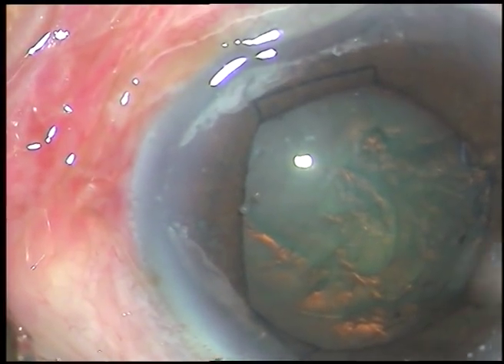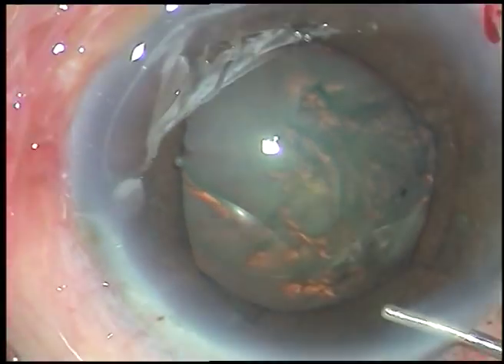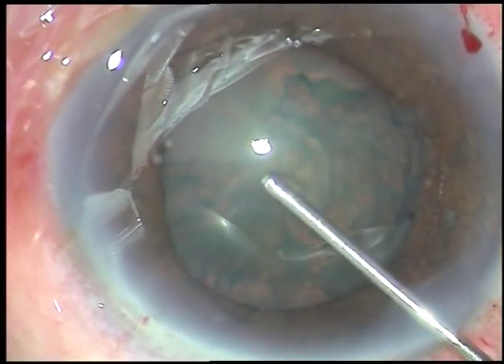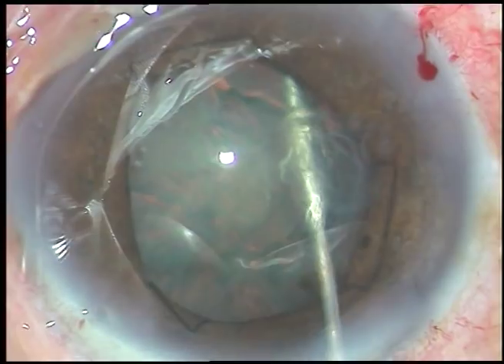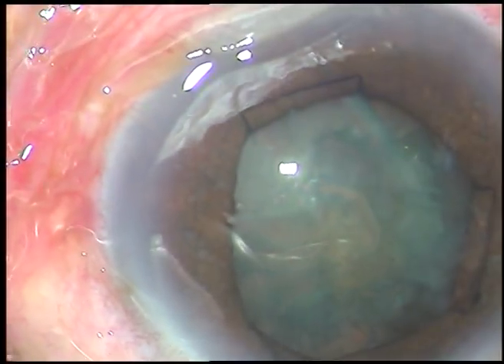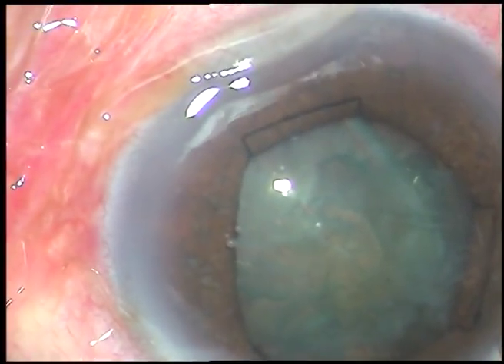Now hydrodissection. The cornea has become clear now — initially it was steamy. So after reduction of intraocular pressure, the cornea has become clear.